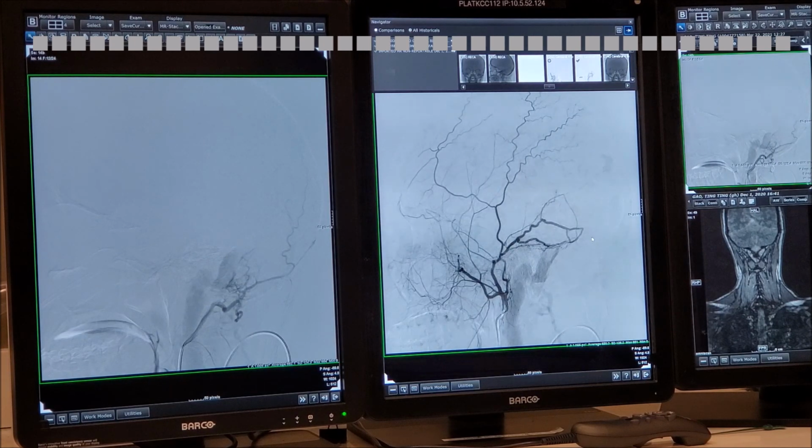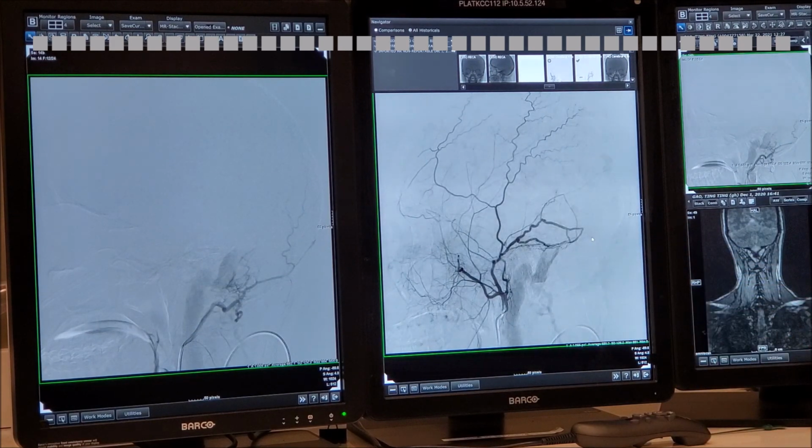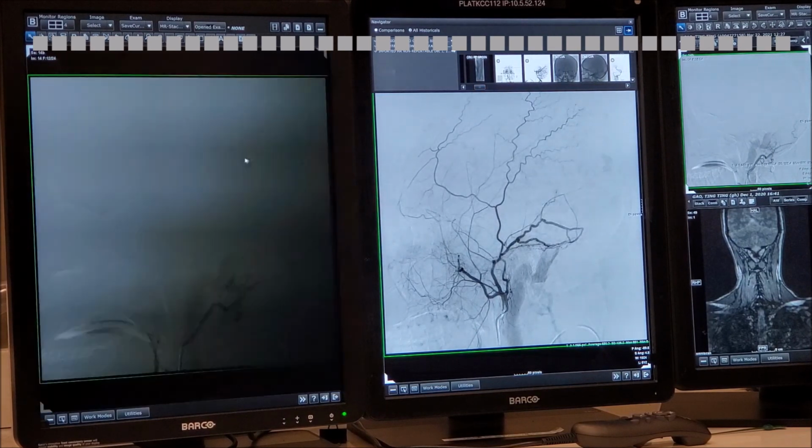The other advantage to putting a Wallstent in this carotid, if we're thinking about it anyway, is that she has that diverticulum there, which may be the reason for her tinnitus, or at least a contributor. No, the tinnitus is this dural fistula. Do you remember the vert we saw? You could put some coils in that diverticulum if you wanted to, on the way. Remember that we had this thing?